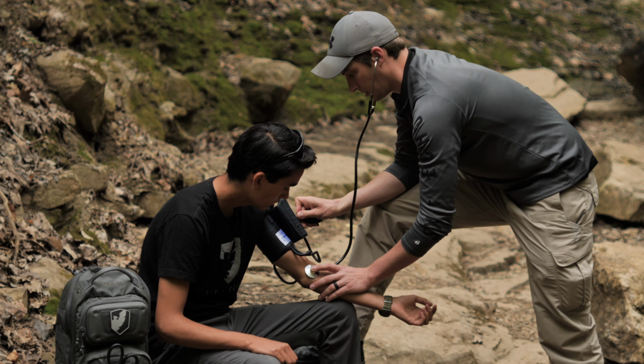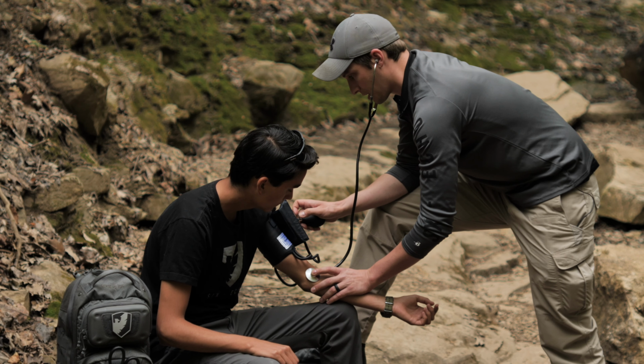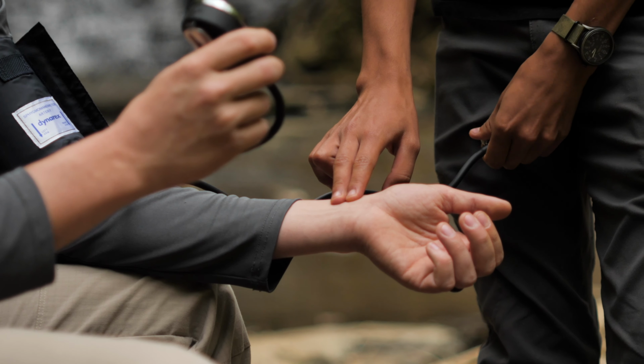The first way is using a blood pressure cuff and a stethoscope. This is the most common way. This is the way you should be doing it. If the blood pressure drops off so low that you have a hard time hearing it, we may have to do what's called a palpated blood pressure. We use a blood pressure cuff without a stethoscope, and we feel for a pulse while we do that, and we'll go over that in a minute. The third way would be just to feel for a pulse. If you feel for a pulse in different locations, that can give you an idea of what the blood pressure or the minimum blood pressure may be for this patient.